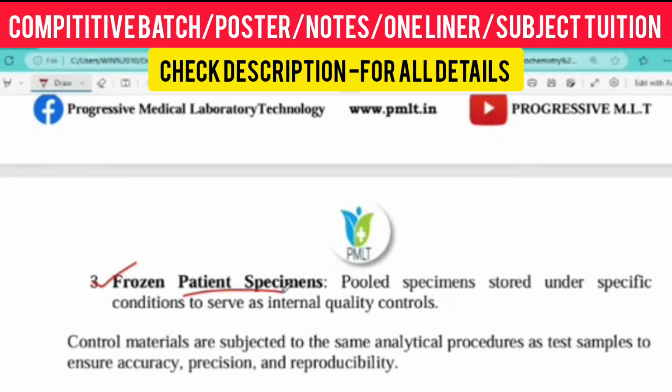If I sum up the materials, the first is dried freeze materials, second is pooled serum, and third is the frozen patient specimen. These three kinds of quality control materials we can use for running quality control. Don't worry, we will learn how it happens.